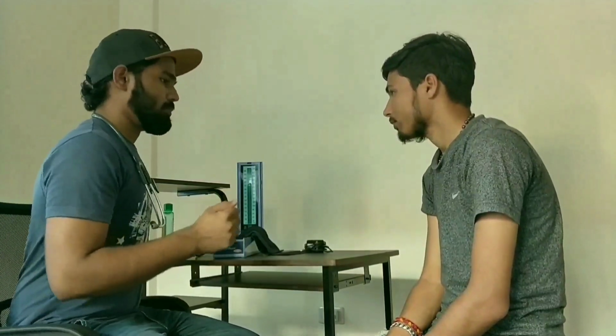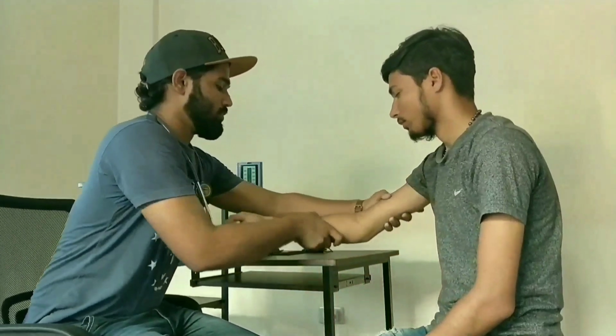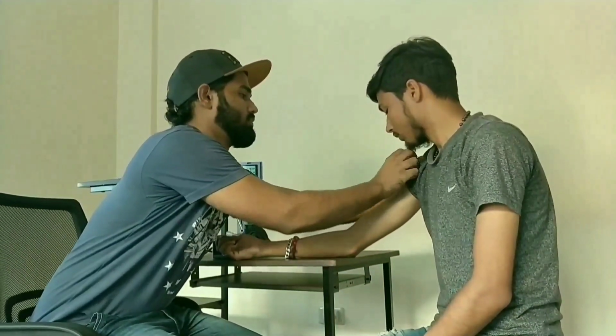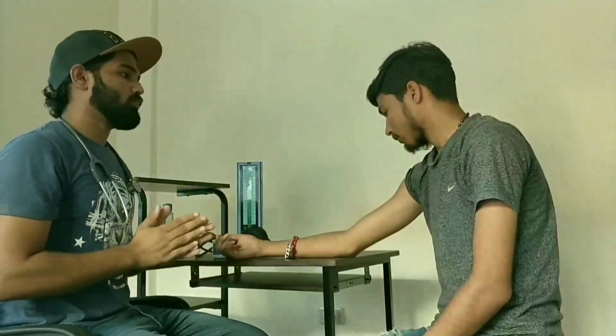Okay, now I'm going to check your blood pressure. Before I check your blood pressure, can you please tell me, did you come here by stairs or lift? Lift. Okay, so before you came here, did you take any beverages, caffeine or alcohol or something? No, I took in the morning. It's okay. Good. Now we will check your blood pressure. So put your hand here. Okay. Do you have any past history of cardiac surgery?